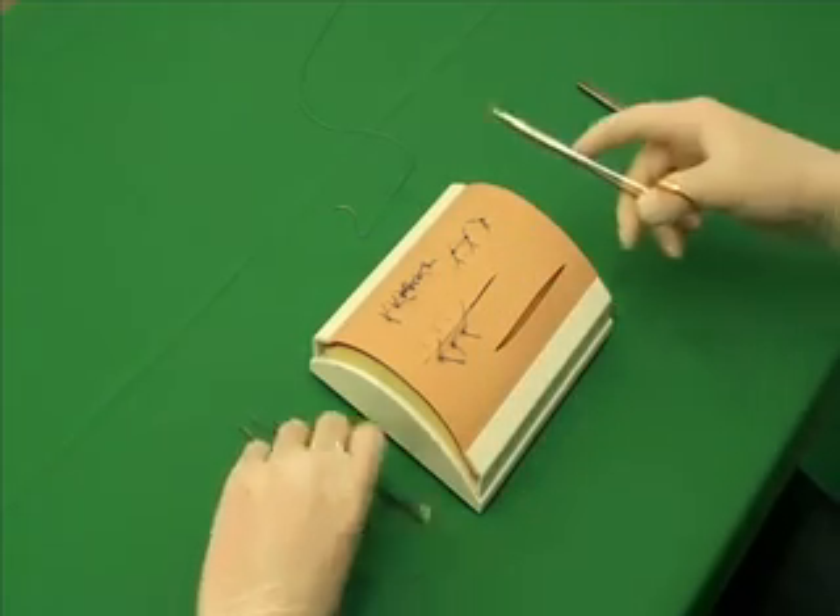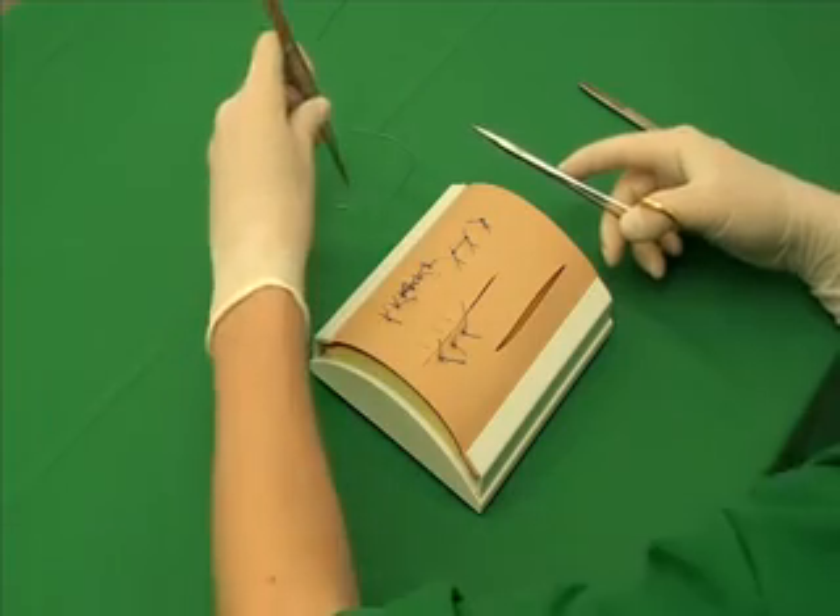In addition to a needle and suture material, you will need needle holders, forceps and scissors.